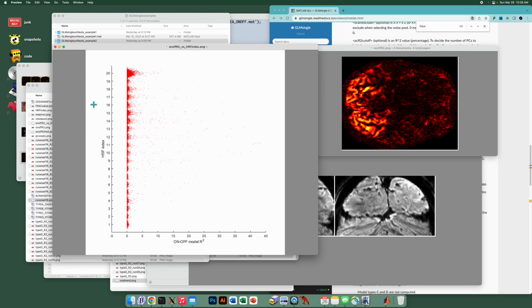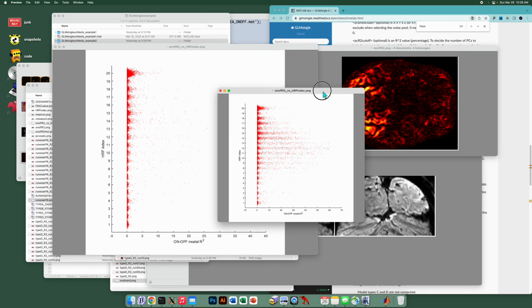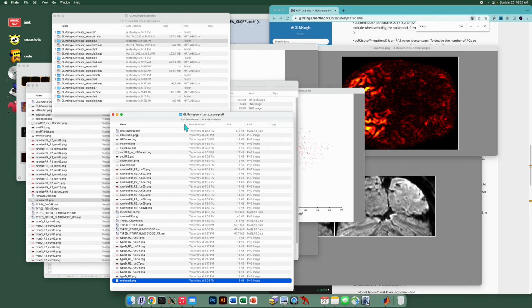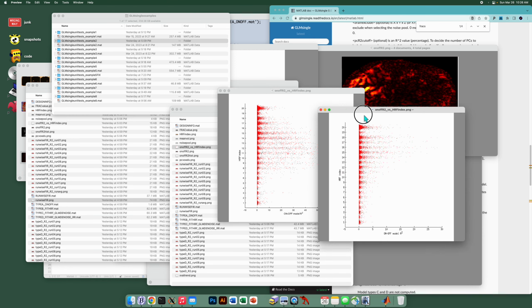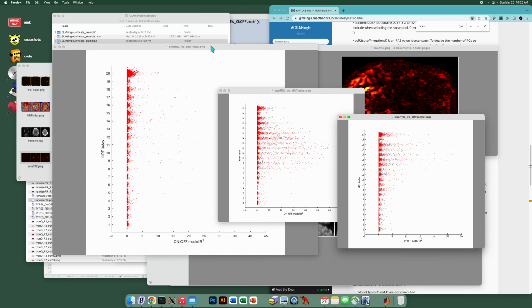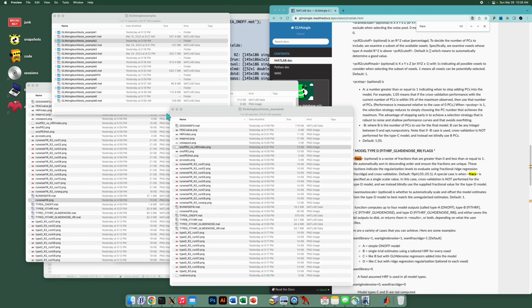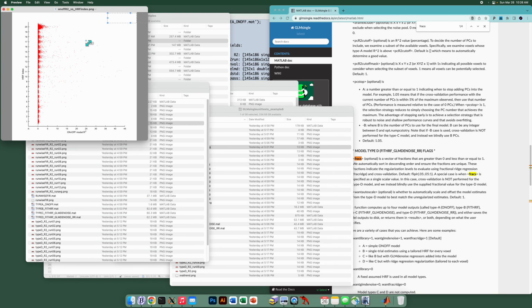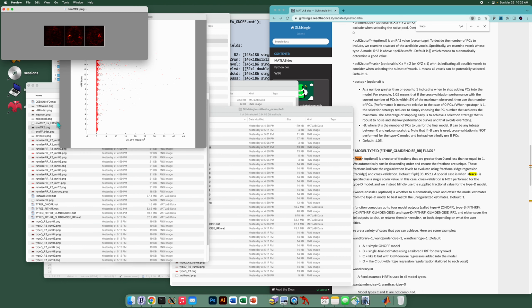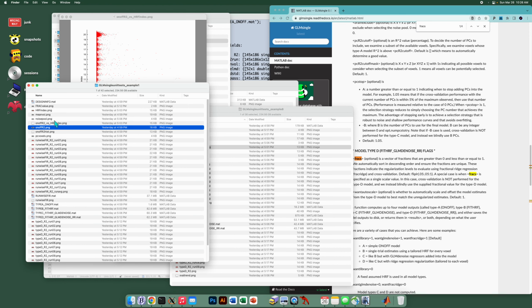Let me pull up a few of these just to give us some diversity. Here's a different data set, and another one. And in fact, I should probably arrange these in a interpretable fashion. Let me actually close this. So let's look at this figure, but also compare against the two things being compared, which is the quick and dirty assessment of where signals are, the on-off r², and the HRF index.